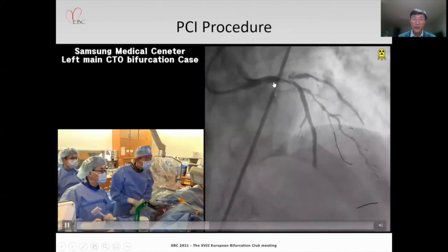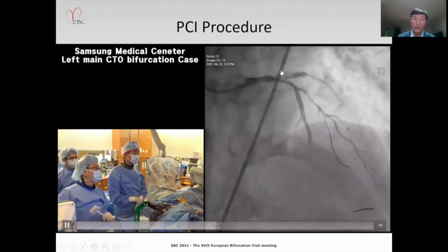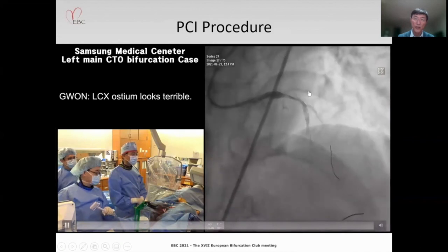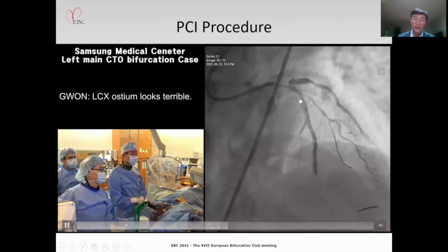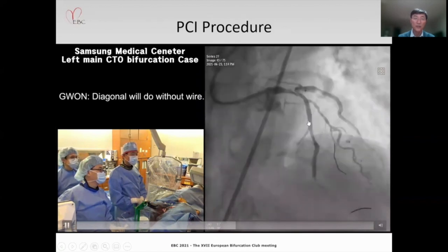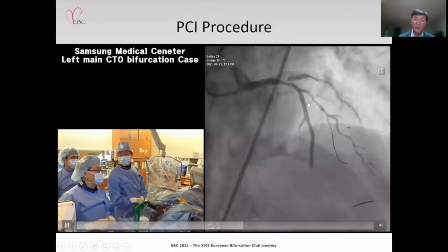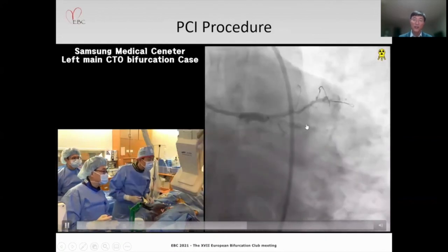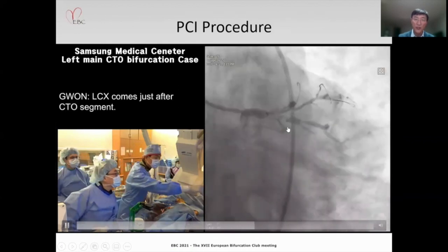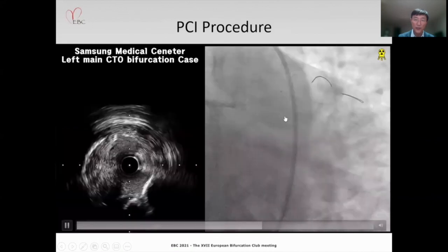And we found that the ugly looking ostium of the circumflex, the angle is really unfavorable, and there was a very tight stenosis. There might be some plaque shift from left main to circumflex. It is very difficult wiring. But the diagonal ostium, I didn't think that we need a wire protection. You can see an ugly looking circumflex ostium again. The plaque is here to here.